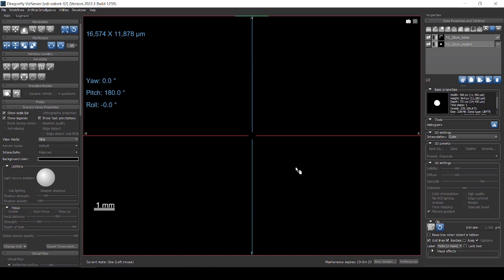All right, today I'm going to show you how to use Dragonfly to calculate the amount of bone that has grown around an implant.